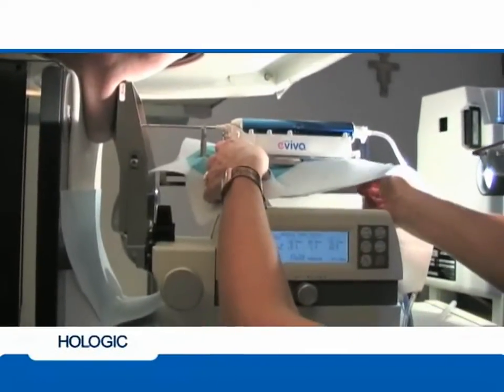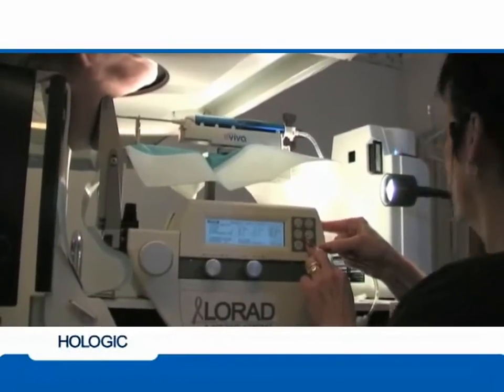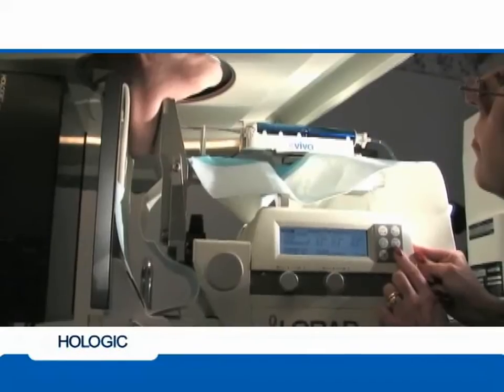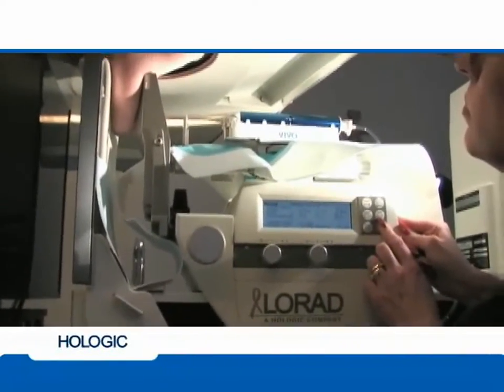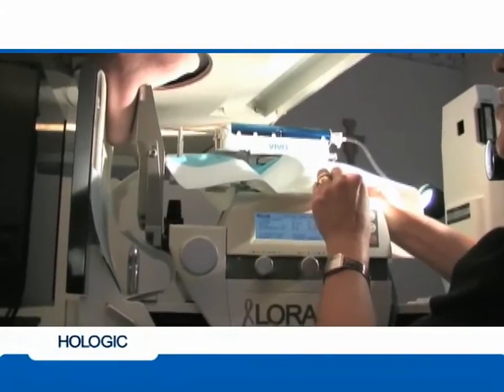Check the security of the device by gently pulling back on the device. The Eviva device is then Z0 to the reference point on the compression paddle with the Multicare Platinum table. The needle must be backed away from the breast before initiating the automatic targeting sequence. Activate the automatic targeting system, motor enable and target position, to move the device to the identified X and Y coordinates. Using the manual Z dial located at the back of the stage, move the Eviva device with the needle tip to the skin surface of the breast to ensure accurate anesthetic placement.